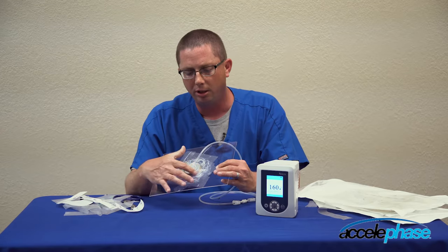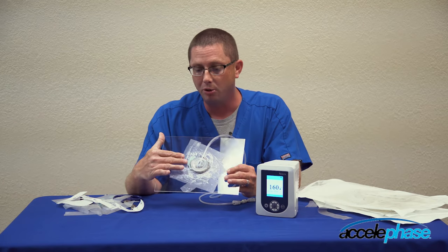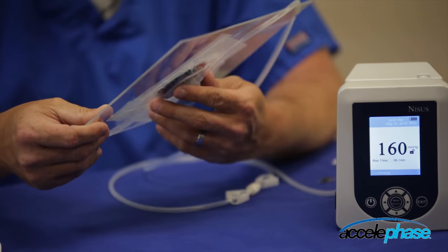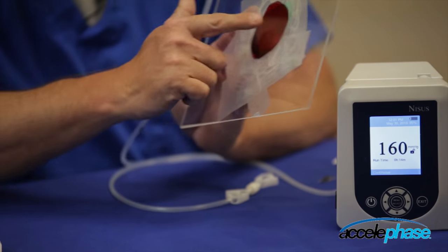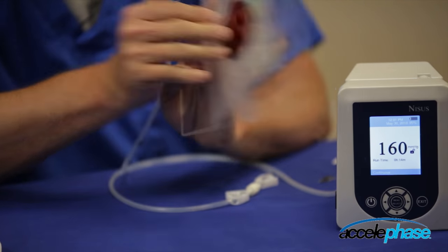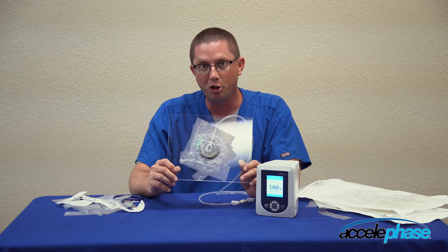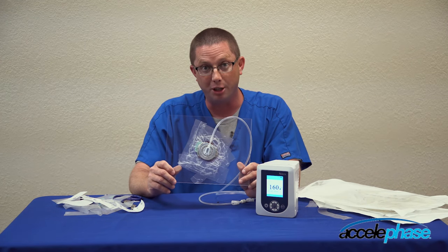The foam will look drawn down and raisin-like in appearance — you can see it from the back side as well. It's completely compressed. This is your completed negative pressure wound therapy dressing application.